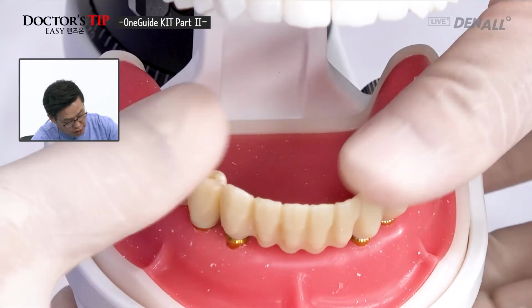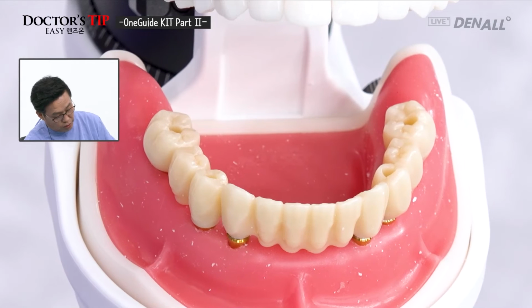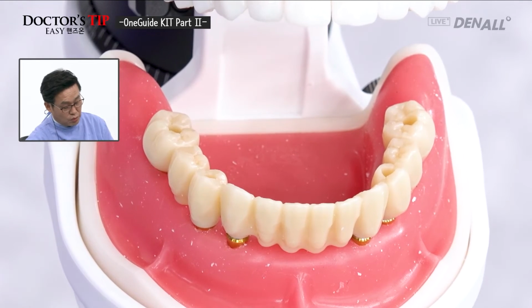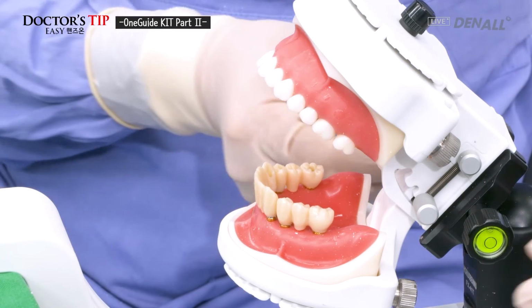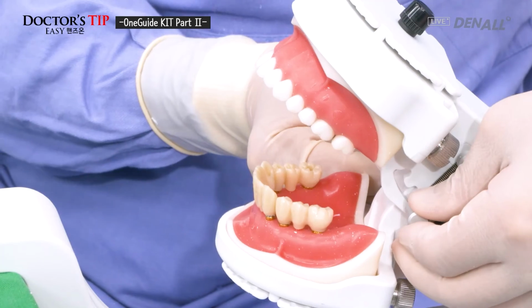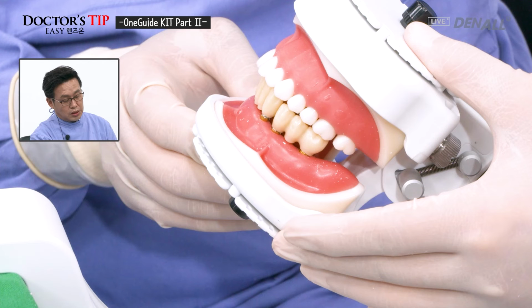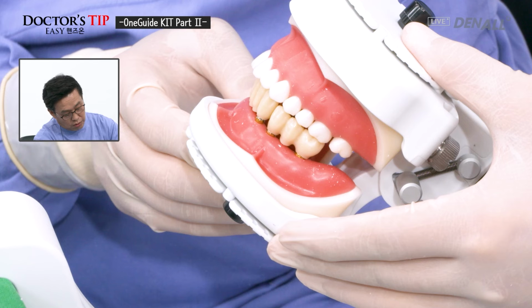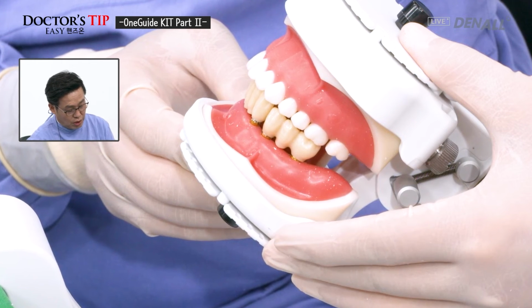As you can see, OneGuide template was used, and we were able to place the implants as planned, and abutments were connected, and final prostheses have been mounted. Provisional has been done well, and let's check at the occlusion and relations with the opposing teeth. As you can see, on computer, we planned the final prosthesis, and it has come out into reality. Now, provisional restorations have been delivered.